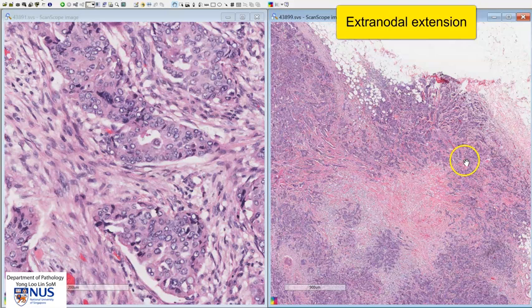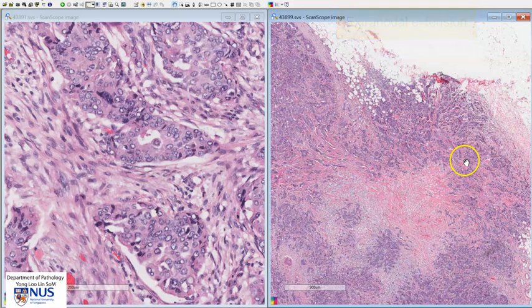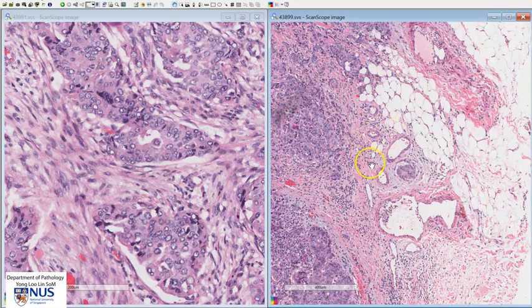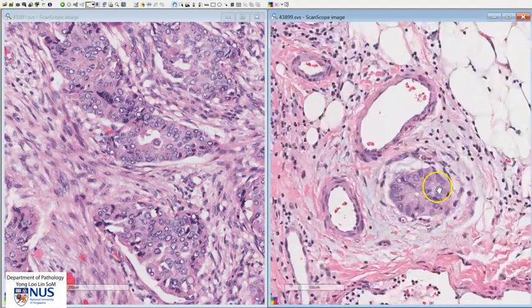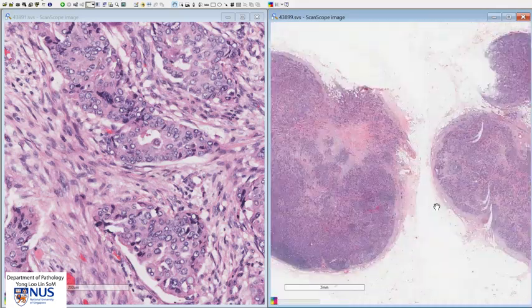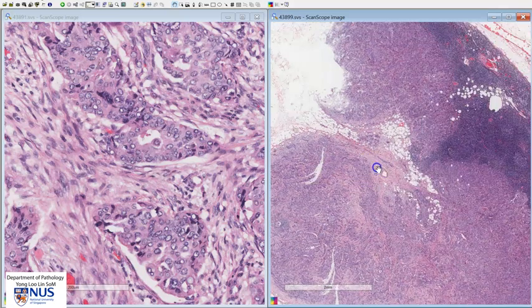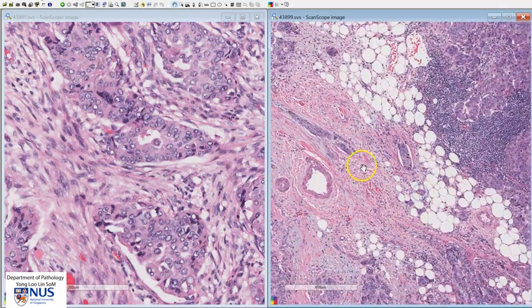The presence of extra nodal extension is a poorer prognostic factor in many tumors. We can also see in the blood vessels around the lymph node that there are tumor emboli in the lymphovascular channels. Here in the other lymph node, we can observe that there are tumor emboli in the lymphovascular channels as well, and this is not surprising because the tumor gets into the lymph node through lymphatic channels.